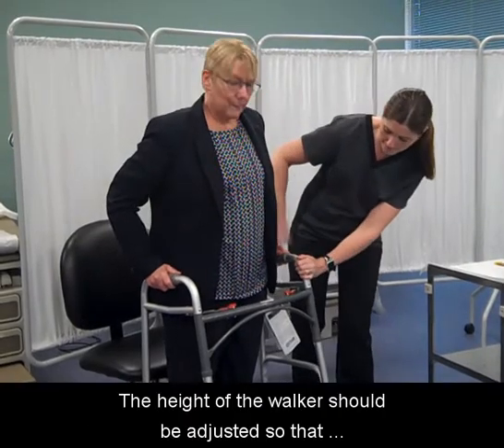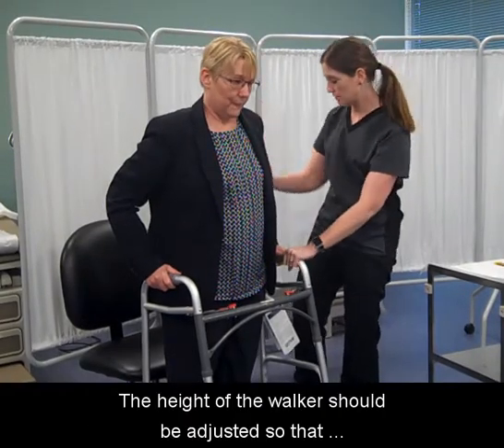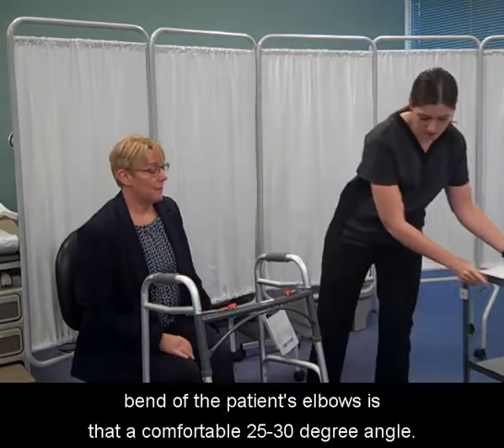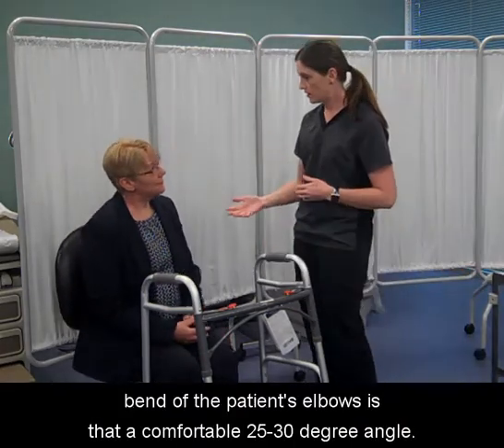The height of the walker should be adjusted so that the handles are at the patient's hip level and the bend of the patient's elbows is at a comfortable 25 to 30 degree angle.